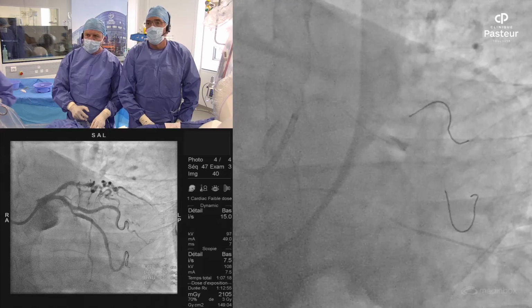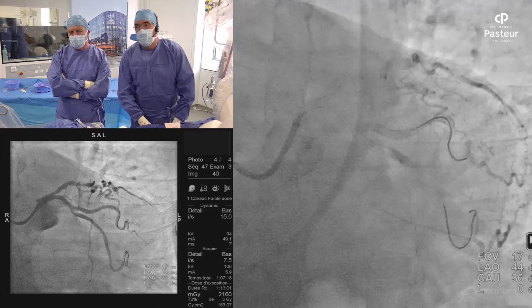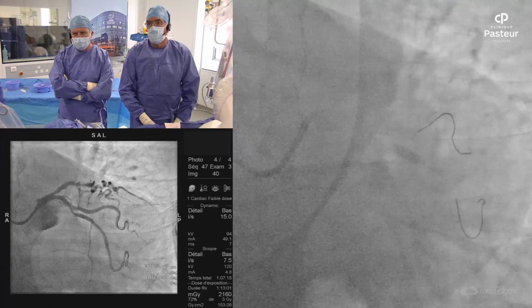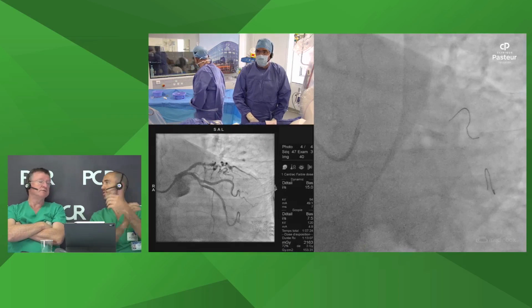Yeah, I think we need 12 or something. 12 by 2.5, 12 or, yeah. Or 15. Give me a 15. Already that OM2 distal to the stent looks better, doesn't it? Just from the wire passage. It's splinted the dissection. It changed the morphology of that segment, the angulation.